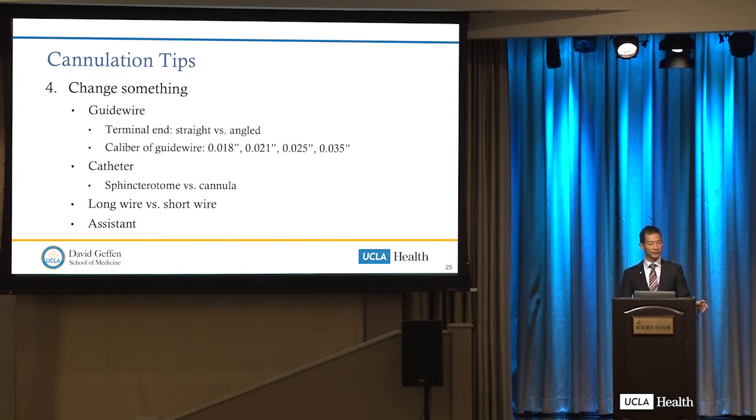It's hard to change the doctor, but sometimes if you're having a bad day with a certain assistant, you may ask for one of your lead techs to come in the room and help you out. We've certainly had cases where you can't get in with an inexperienced tech. I asked for the more experienced tech to come in, and within a minute or two, we're in the bile duct, right? It's as simple as changing the tech in certain cases.